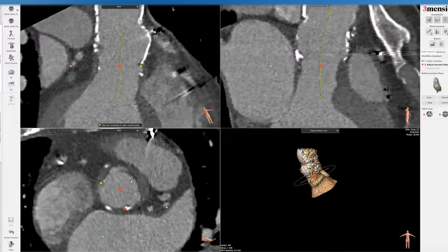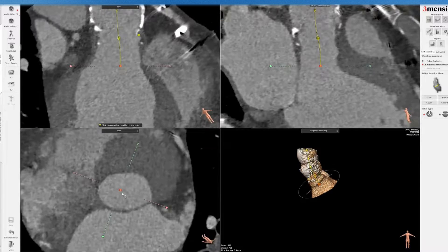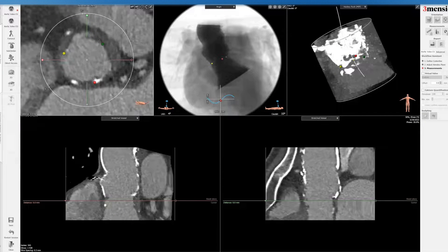I'm going to shift this here so that we can delineate the color coding of the dots, and then center the LVOT line as well, just to make sure the LVOT measurement will be accurate, and then click confirm. Once you're here, you can basically measure the base of the annulus that we put together. Mean diameter is 25mm, so this would be a 26mm balloon expandable valve or a 29mm self-expanding valve. You can see it looks almost like a native annulus, but there's a lot of calcified anatomy.